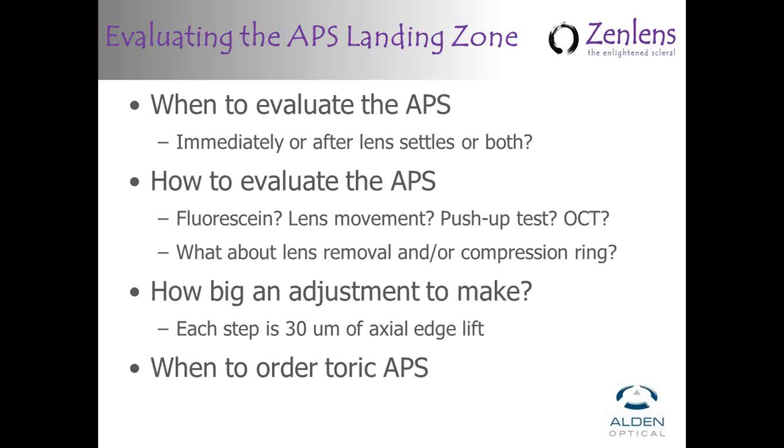One great tip I heard was if a patient has a scleral lens on their eye, if you have them close their eyes and squeeze their lids hard, if the edges are too tight, they're going to give you feedback that they can feel the edges in certain parts of their eye. So I don't have hours and hours for a lens to settle on a patient's eye before I reassess it.